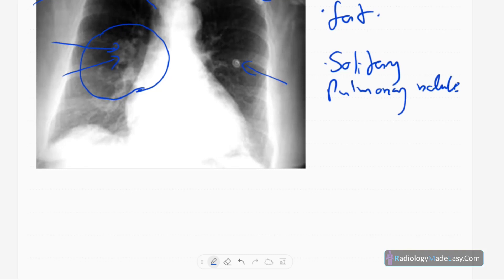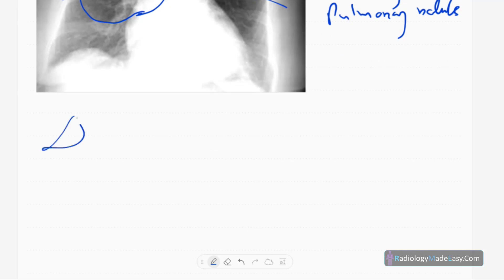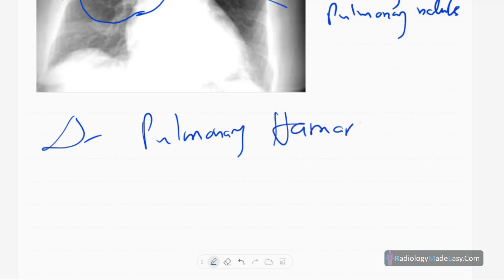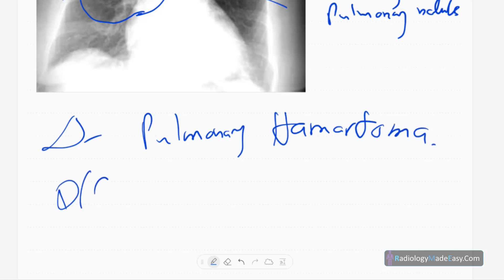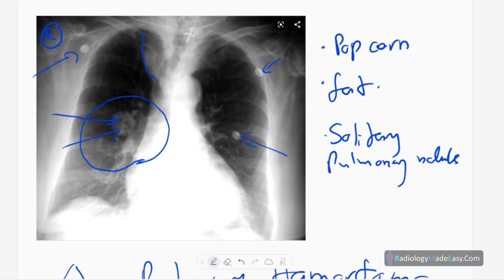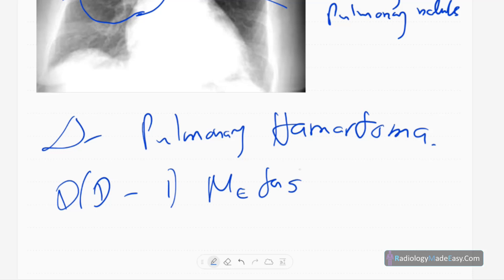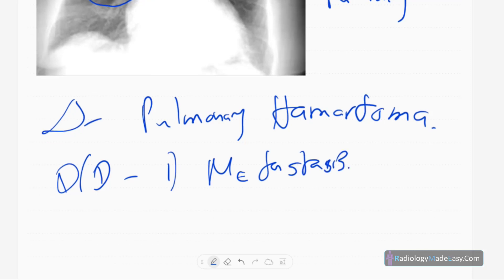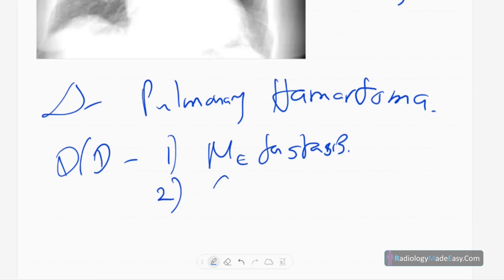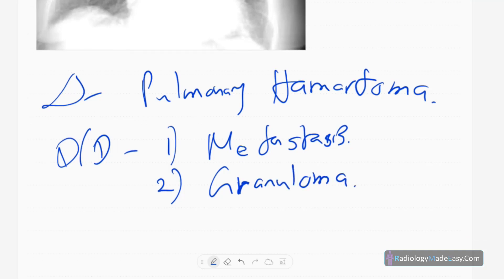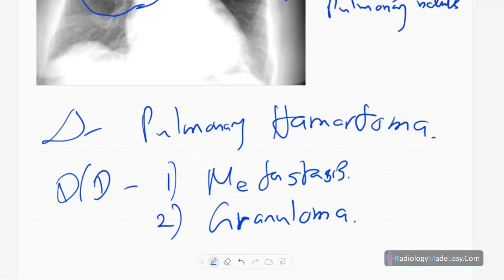The diagnosis in this case is pulmonary hamartoma. The differential diagnosis for this kind of calcified soft tissue nodule includes: calcified solitary metastasis such as from osteosarcoma or chondrosarcoma, and granuloma due to tuberculosis. Those are the key differential diagnoses for a calcified solitary pulmonary nodule.